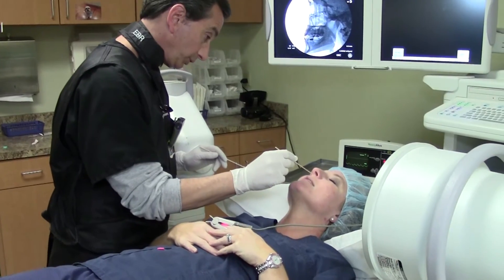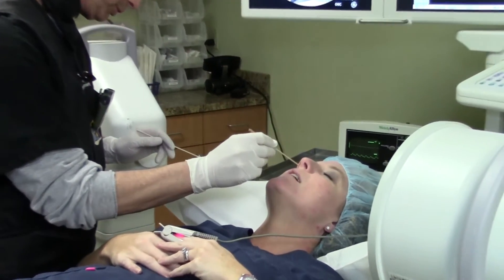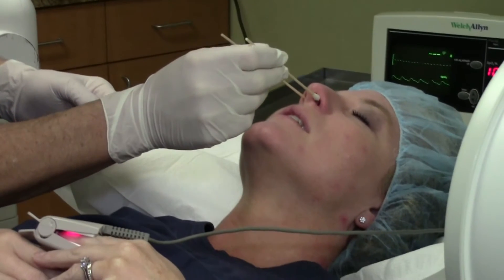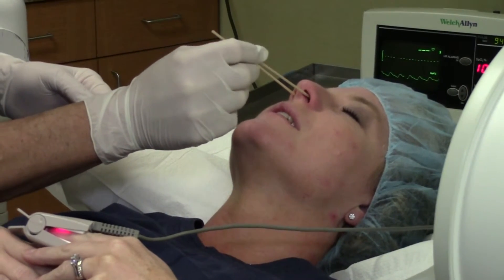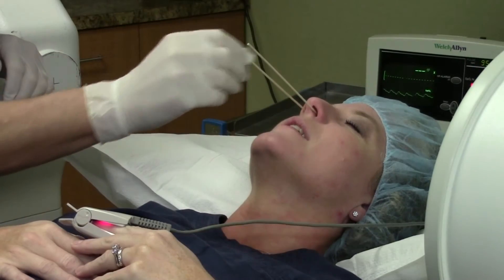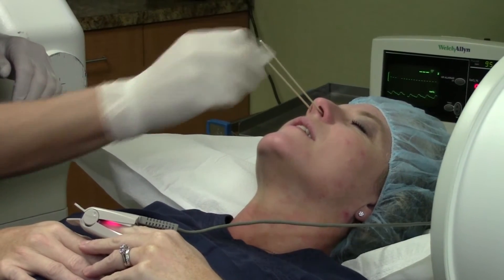The initial step is taking cotton swabs that are soaked with lidocaine jelly, and as you can see, I am going to anesthetize the nares bilaterally, and I will do this for several minutes.